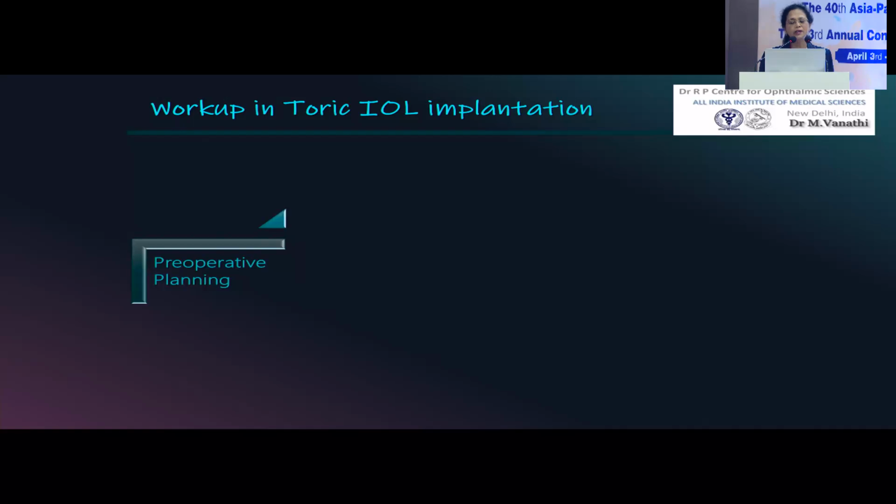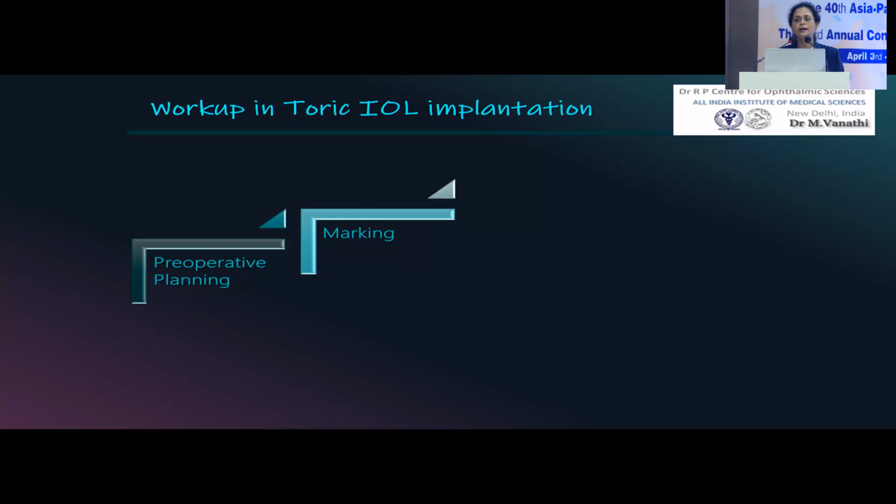You will also need to spend your extra few minutes to look at and please finalize your IOL power and the lens and your other parameters before you take the patient onto the OT and before you send the patient on for your counseling here. On the day of surgery, what's important is the marking of the axis. So improper marking several times would probably be the reason why the patients are unhappy or have a wrong implantation.